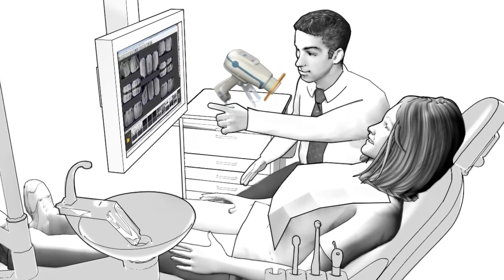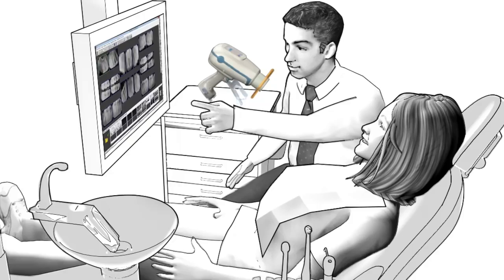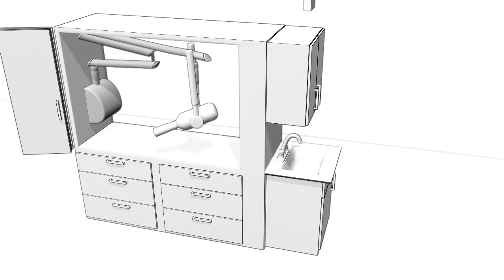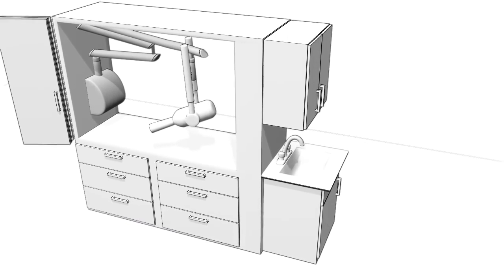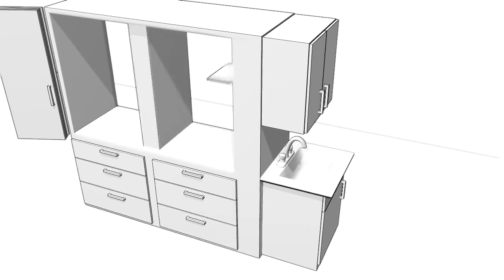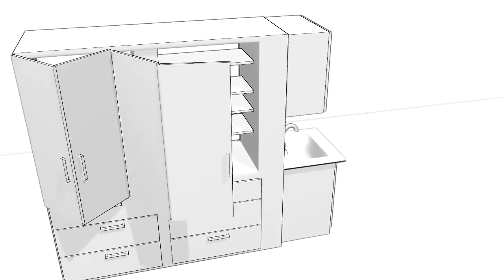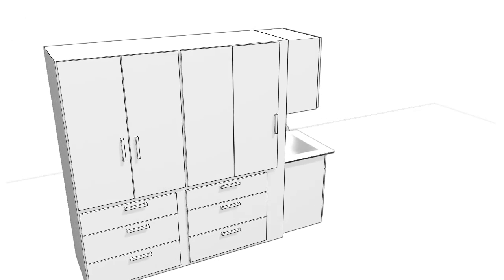Plus, the Nomad Pro 2 makes you and your practice more efficient. How would you like more room in your practice for additional storage? When you move to Nomad Pro 2, you can reallocate pass-through cabinet space to extra storage. The Nomad Pro 2 helps you keep a neat and tidy office space. Still using old conventional wall mounts? Upgrade to Nomad Pro 2 and use that space to hang a picture instead.